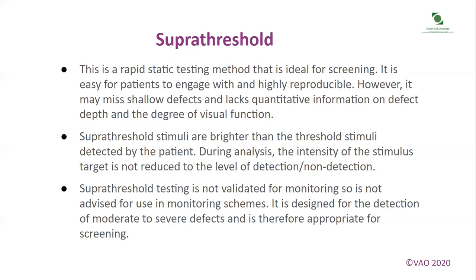Suprathreshold stimuli are brighter than the threshold stimuli detected by the patient. During analysis, the intensity of the stimulus target is not reduced to the level of detection or non-detection. Suprathreshold testing is not validated for monitoring, so is not advised for use in monitoring schemes. It is designed for the detection of moderate to severe defects and is therefore appropriate for screening.